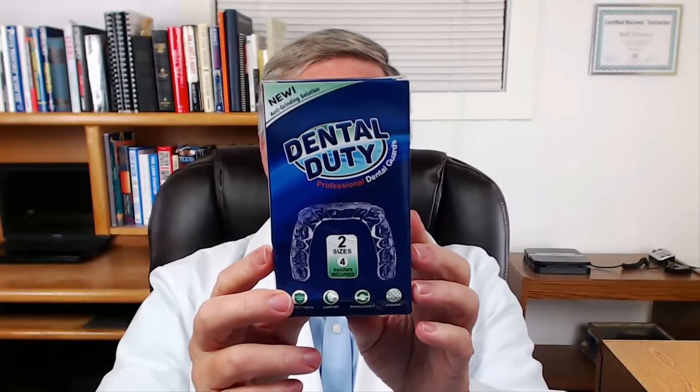Here's another nice thing about this company, Dental Duty: if you mold it incorrectly and there's nothing you can do about it, they will send you another one free of charge because they want to make sure that you get it right. It does take a little bit of skill to get these right. This Dental Duty box comes with four molds — two of the smaller size and two of the larger size. Today I'm going to show you how to apply and do the mold on the upper teeth.